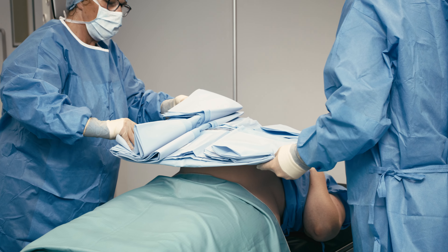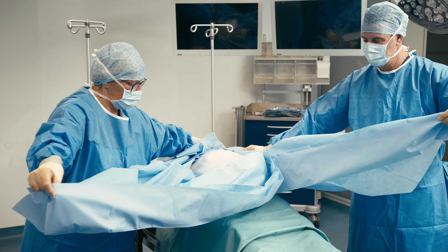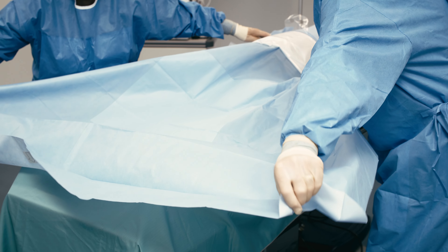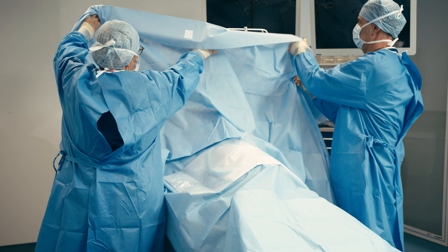Gently press the adhesive film to the operative site. Unfold the drape in line with the directional arrow towards the lower half of the patient, completely covering to the end of the table. Unfold the top half of the drape towards the head of the patient.